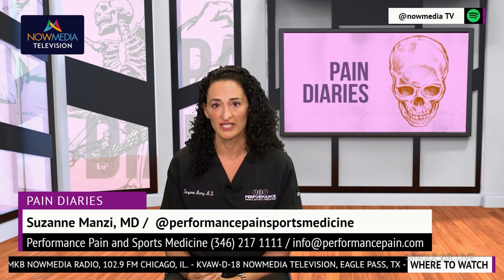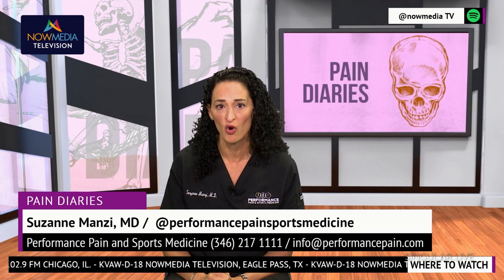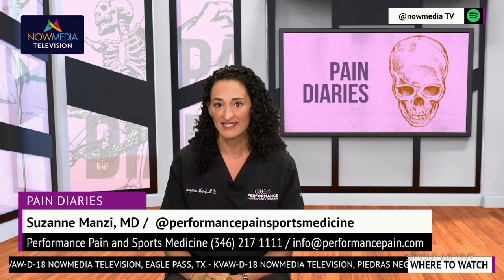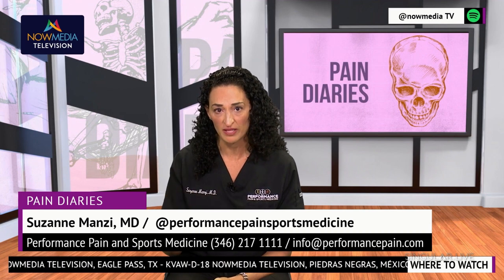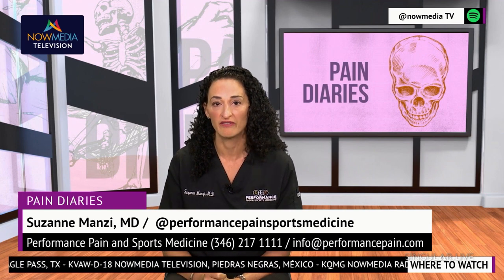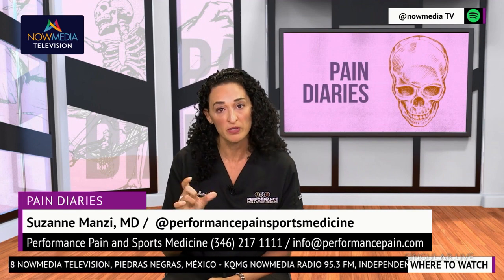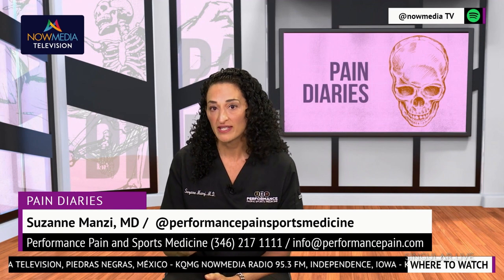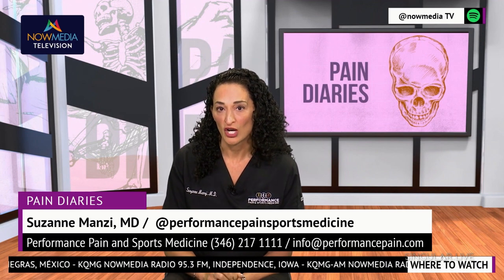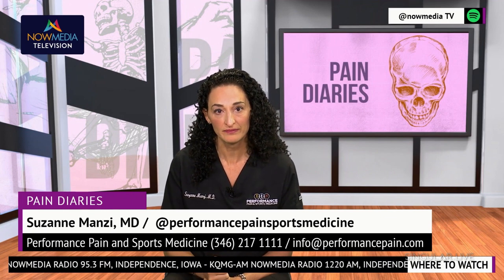Spinal cord stimulation is a procedure typically done on an outpatient basis, which means patients can go home the same day. During the procedure, the device is implanted under the skin near the spinal cord, and the patient then will undergo a trial period where the device is turned on and off to determine its effectiveness, and different programs are put in the device. If the trial is successful, the device will be permanently implanted. Usually the trial is done in an office, and the implant's done in an operating room type setting.